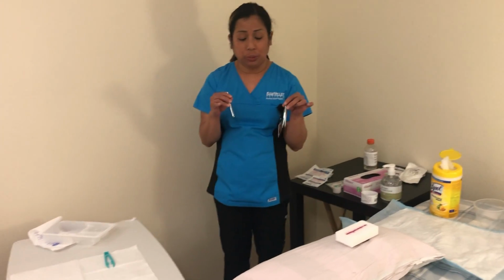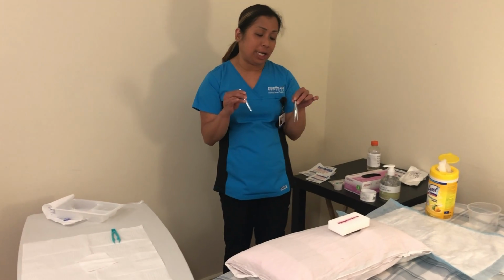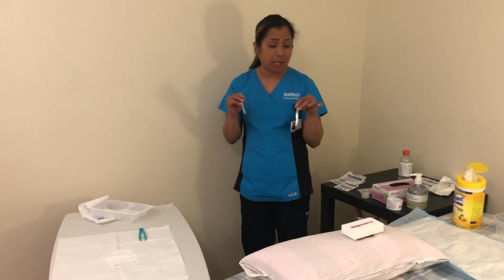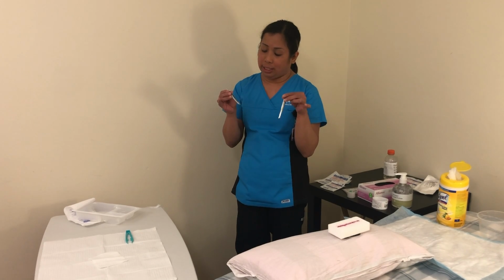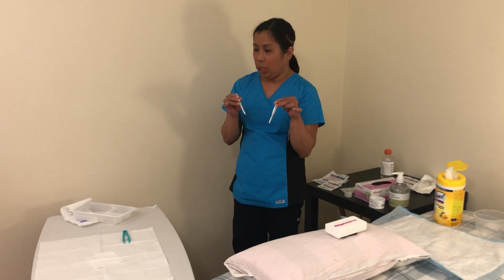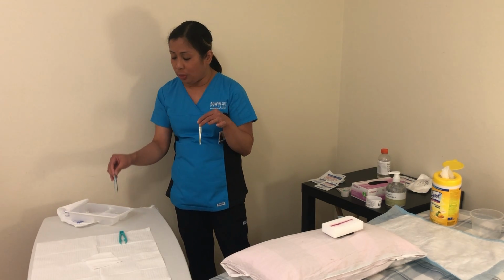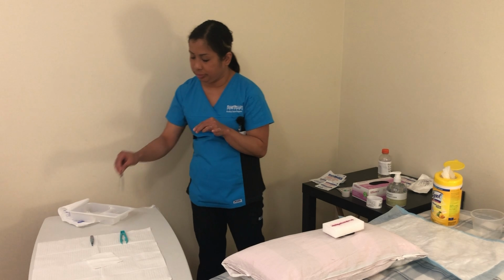There are two ways: let it dry by air, or you can dry it with sterile gauze. It's up to you. So assuming that it is air dry already, and the tip is already wet, I let it dry, and then I will put it away here at the side, just in case I will use this one later on. Okay, here.